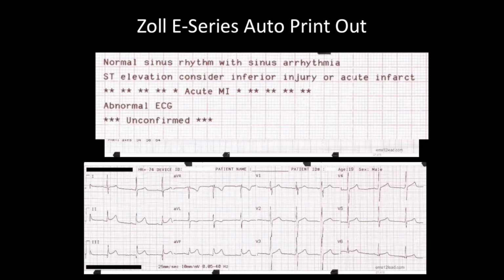So what I would do is, you have a chest pain patient, you arrive there, you do your 12-lead EKG, you print it out, you see this on the strip, pucker factor goes up, for some more than others, I know, Jimmy. But now I'm more ready, so now I want to worry about aspirin, and ideally I've already placed them on oxygen, I want to worry about transport. I'm going to move the patient, I'm going to talk to medical control when I can, but I'm going to start driving to a hospital.